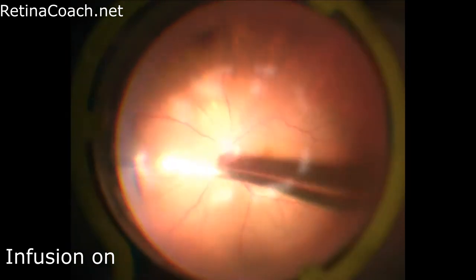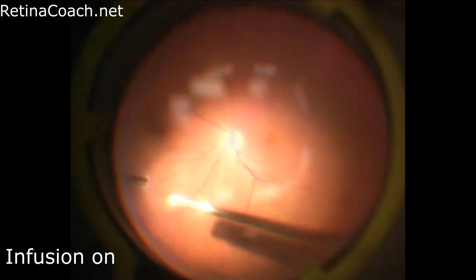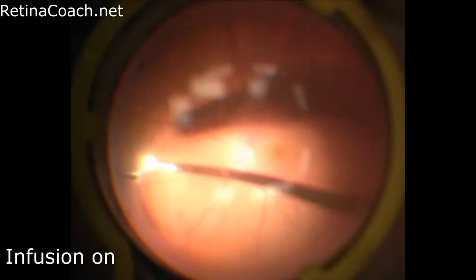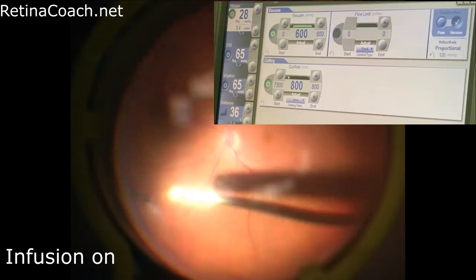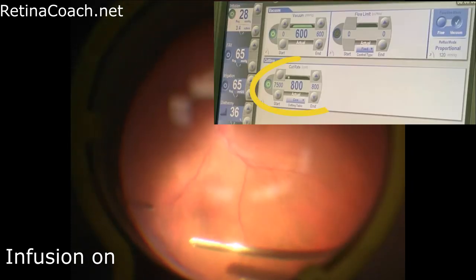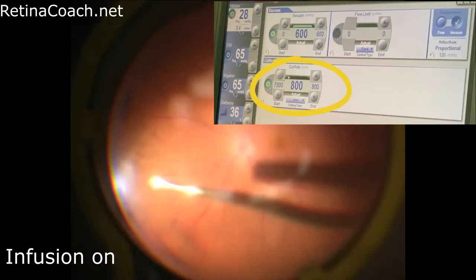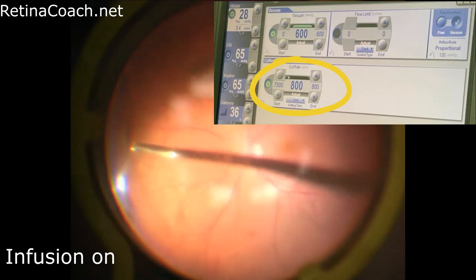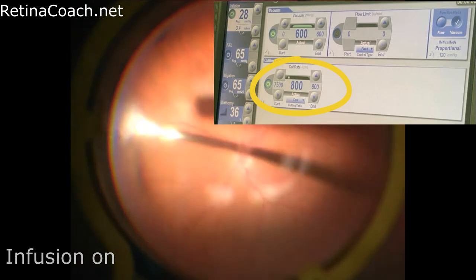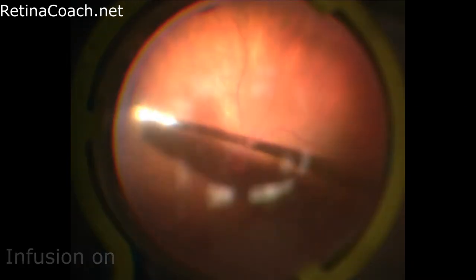Another important tip for diagnostic vitrectomy is to reduce the cut rate to less than 1000 cuts per minute to minimize morphological alterations in the sample.